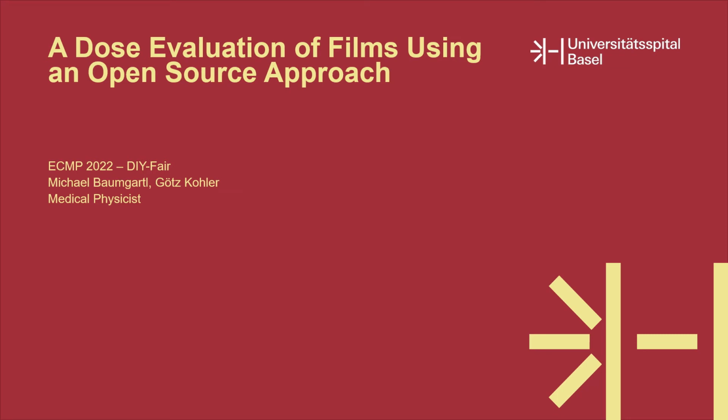Hello, my name is Michael Baumgartl and I'm a medical physicist, and I would like to present to you a dose evaluation of films using an open source approach. As you all know, it is still common to use radiosensitive films for dosimetric evaluation of dose distributions in quality assurance. And the main benefit of that is the high spatial resolution of the films.